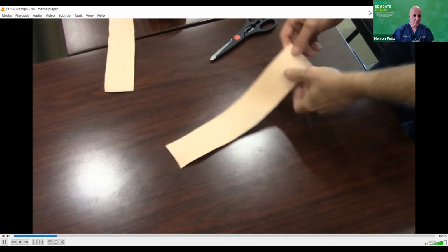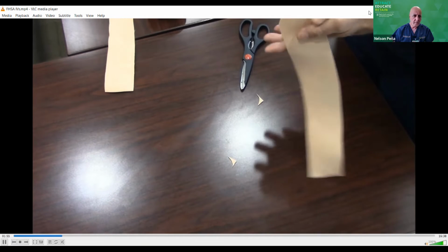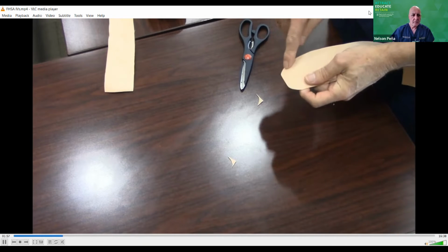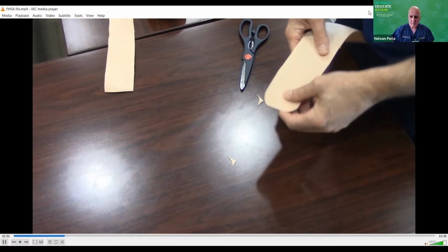Okay, once you've cut your strips, you're going to want to round off one end just to make it nice and smooth and look good. So you just round off the corners. And leave it like that. So now we got a nice smooth end. This is going to be our attachment point.